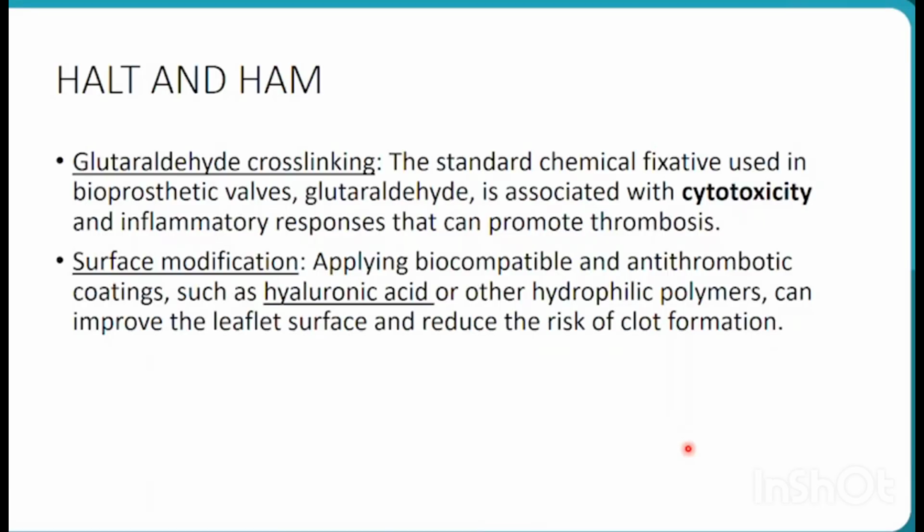So that's it about the comprehensive echo evaluation as well as the various modalities used to evaluate the prosthetic heart valve. Thank you.